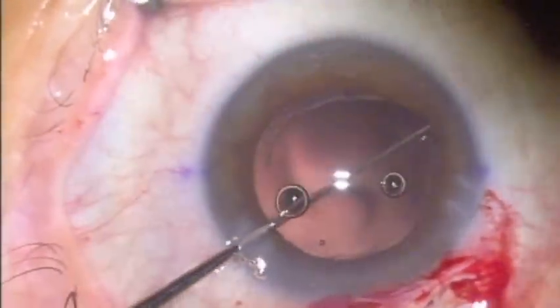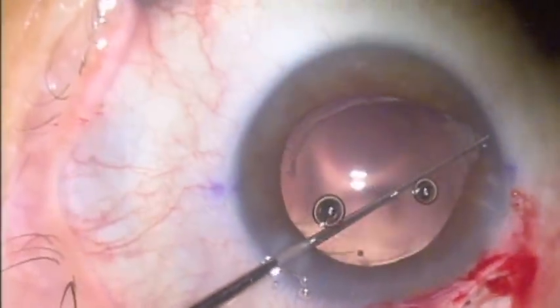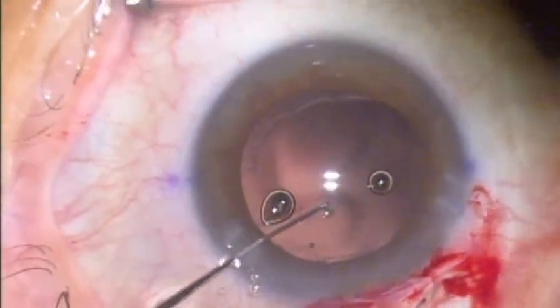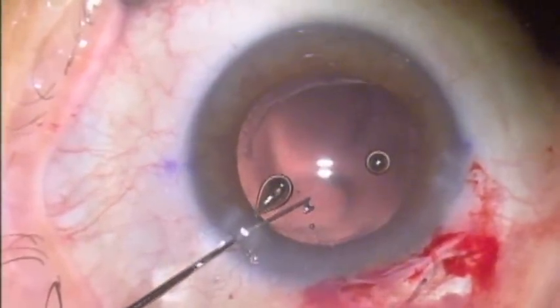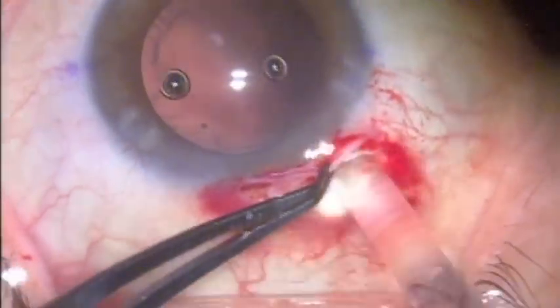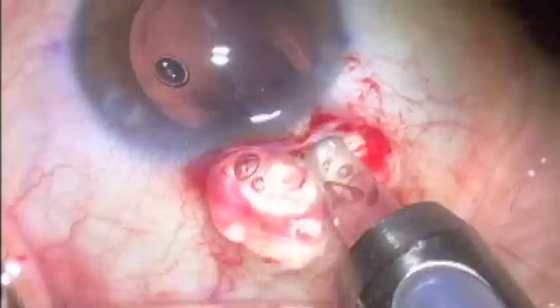Here I'm manipulating that part of the CTR which had been overriding the anterior capsule into the capsular bag completely. After inspecting it, we were able to reposition that part fully in the bag.